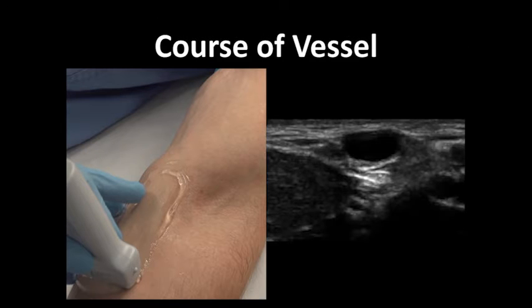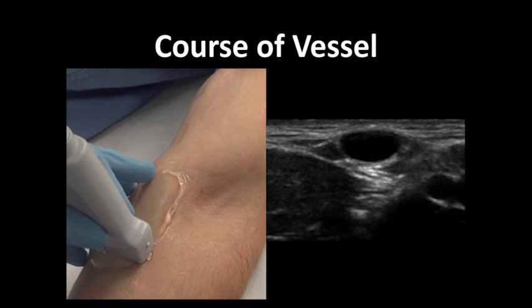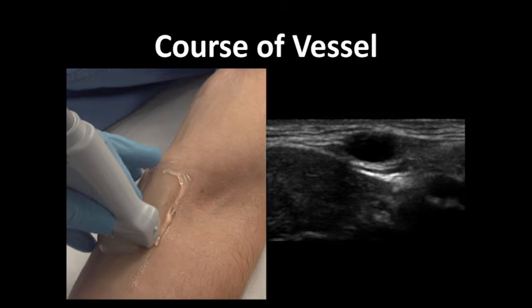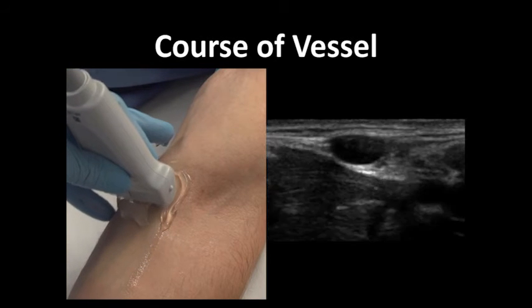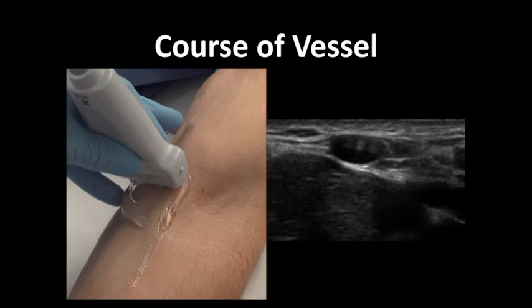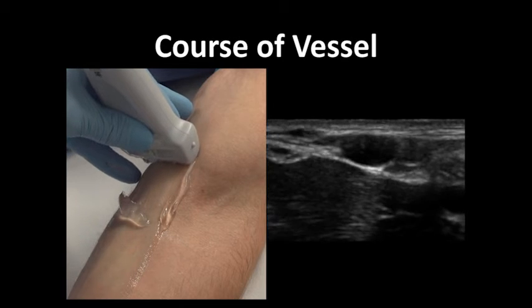Occasionally, clinicians fail to pass a catheter in a vein because, despite getting a flash of blood, the vessel is too tortuous to allow passage of the plastic catheter. To avoid this, once you find the vessel of interest, scan up or proximally along the limb to ensure that the vein stays in the center of the screen and thus has a straight course for a few centimeters.